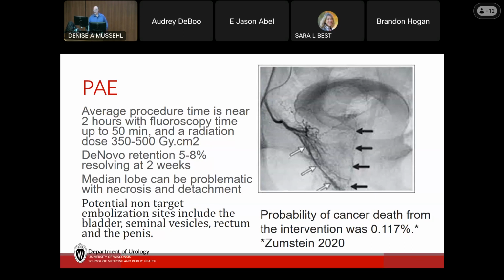In addition, different than most embolizations that people in IR do, they have a way to do this that they call the perfected technique, where they embolize proximally rather than distally first. And that's supposed to decrease the chance of sending the embolization into some of the other non-target areas.